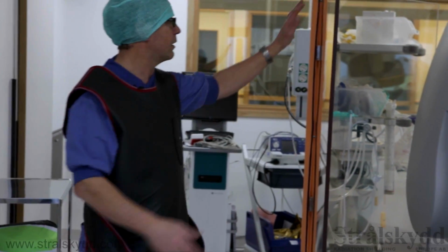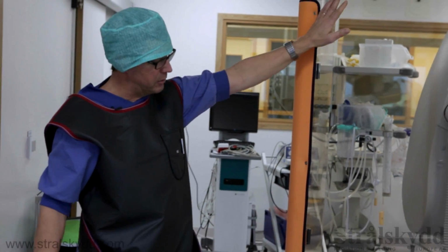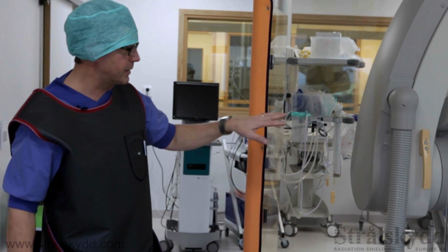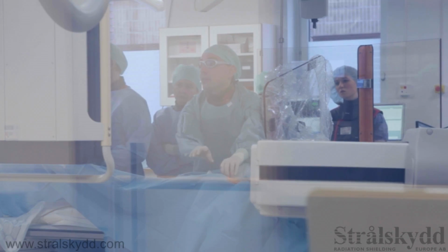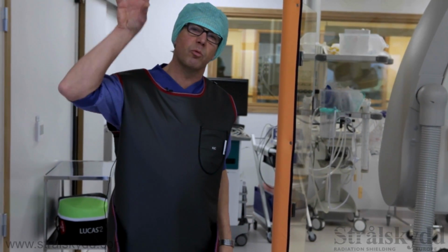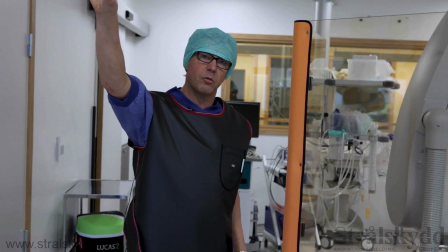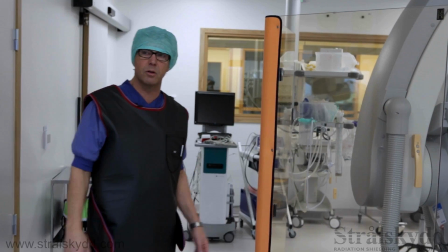And one thing that is quite neat, I think, is that this is totally see-through. So I see what happens with the tube. I can see all of the patient. I can see all of my staff and talk to them. And in this cath lab, we would have a monitor up there, which means that I can concentrate on the patient and have the vital parameters over there.